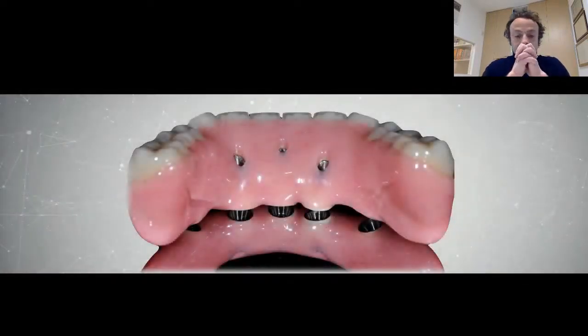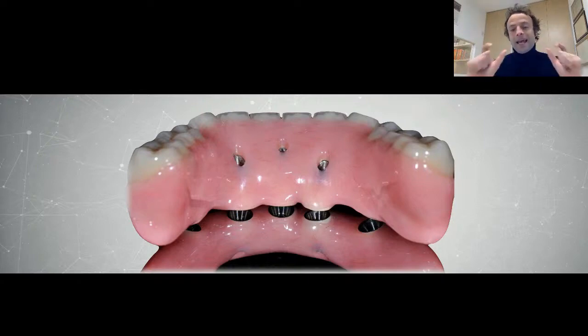But about the stability of this approach, it's really important to remember that a crucial aspect is the section, the volume of the prosthesis. If you have a full acrylic prosthesis like this, with this kind of thickness, with this kind of height, of course, probably you don't have any risk in terms of fracture, because this kind of prosthesis with this kind of thickness has the same strength as the metal, maybe not exactly the same, but for sure achieves really incredible results, really similar to the metal.